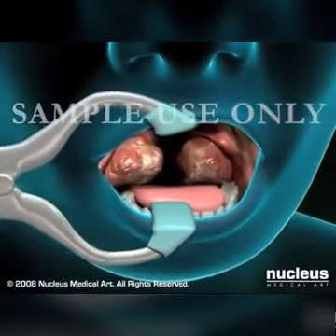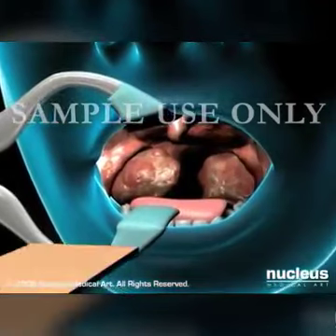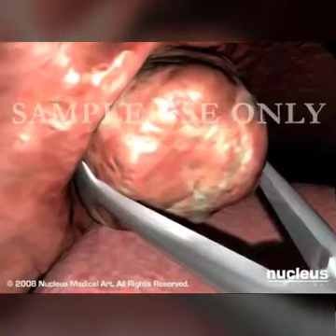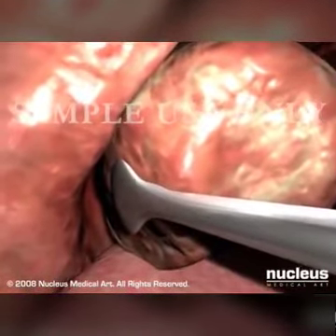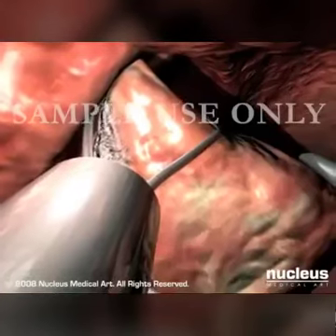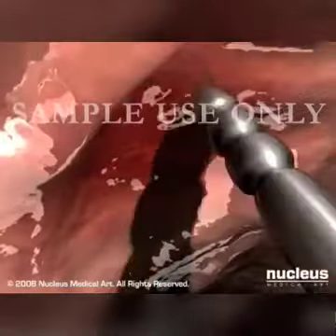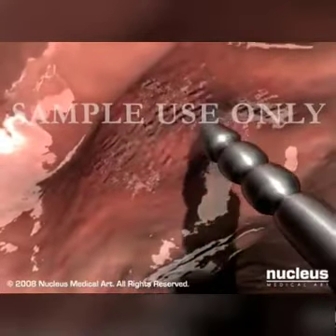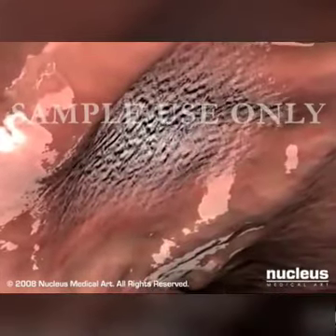During your tonsillectomy, your surgeon will use a special retractor to hold your mouth open and a tongue depressor to ensure an unobstructed view of your tonsils. Your surgeon will grasp each tonsil one at a time with tonsil forceps, cut it away from the surrounding tissue, and remove it with a snare or a tonsil guillotine clamp. Electrocauterization or clamps and ties will stop any bleeding at the site where the tonsils were removed. This area generally heals naturally without stitches.